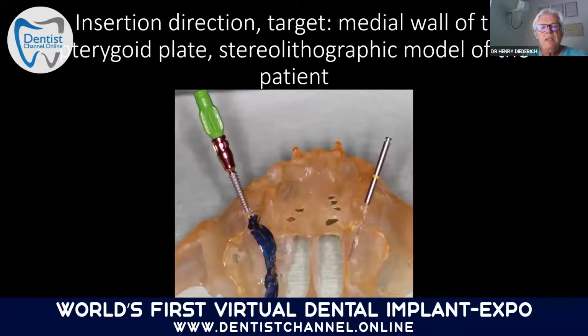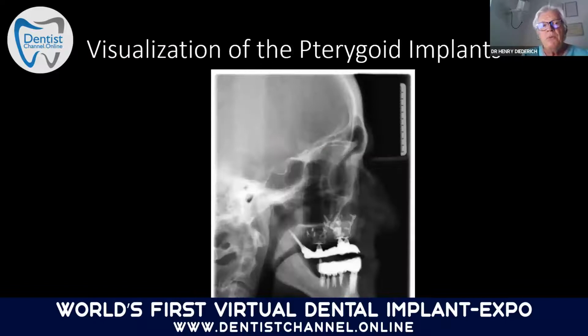You see here the insertion direction. The target is the medial wall of the pterygoid plate, and you may prepare a stereolithographic model of the patient, and you may train. This is a way how to learn it before. And then here you see our visualization of the pterygoid implants. Now, personally, I do it always freehand, but also you may do it by guided surgery. So for beginners, it should be interesting to do it guided in order to be sure. But you see here, left and right side were done at the same level freehand.